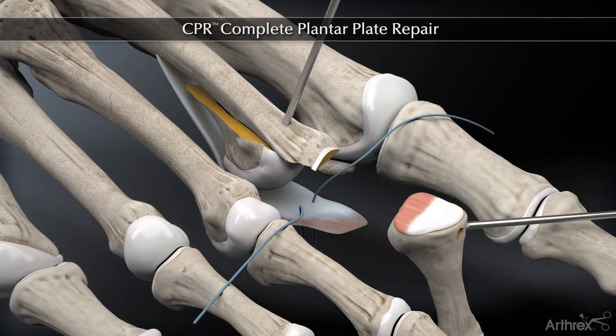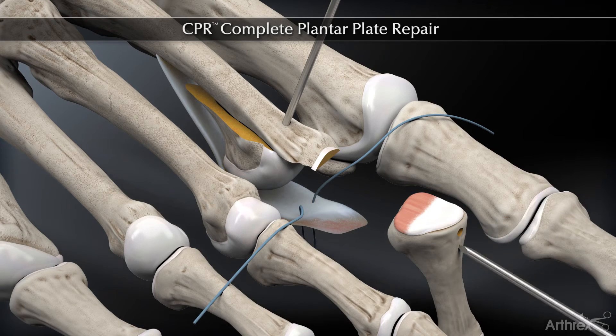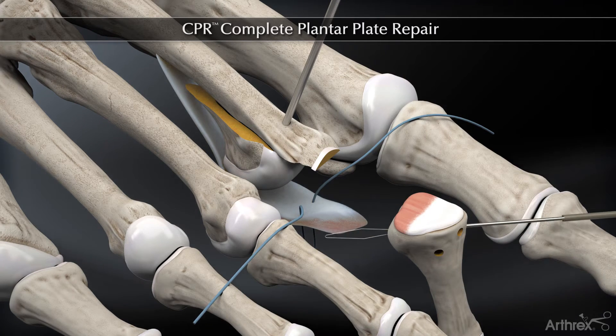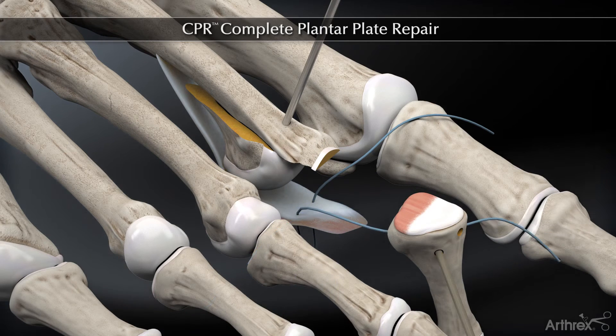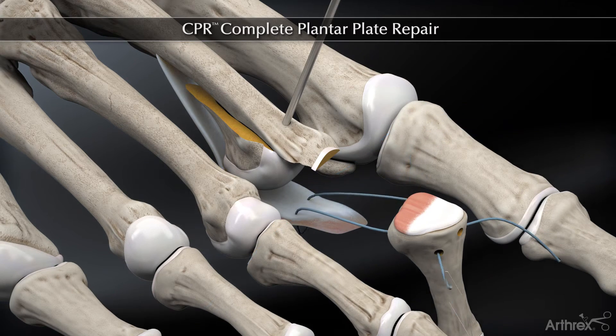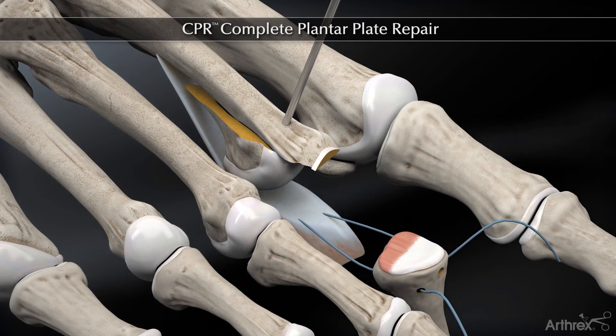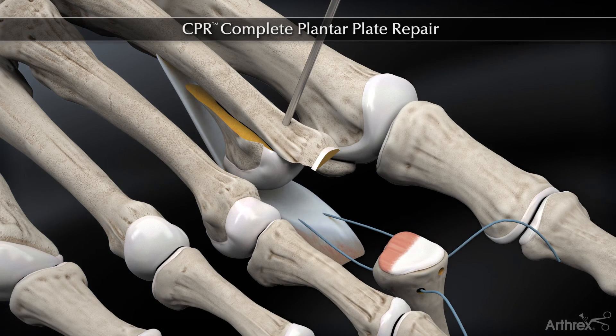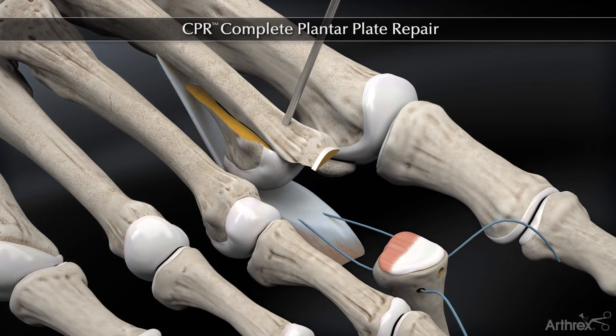We place drill holes in an oblique fashion or vertically on the medial and lateral aspect of the proximal phalanx — this is where we will secure our sutures. We use the suture passer with a nitinol loop and bring the sutures through that drill hole, which is where we will secure the plantar plate.